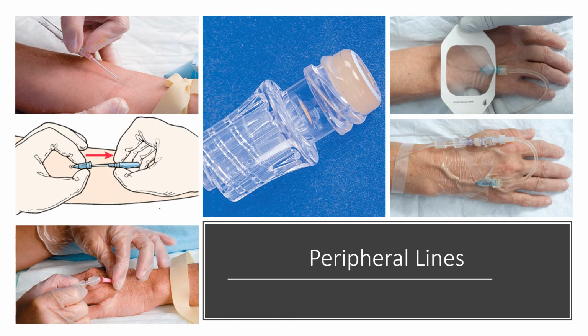And then below that, you can see where the catheter is just there with nothing attached to it. This is where we attach the IV tubing, and the IV tubing will have that blunt end on the end, that needleless system there, that blunt plastic catheter for us to be able to access. And then once that is all attached, we will put a dressing on this. We usually place a Tegaderm dressing on this, and then we're able to attach this to our IV.